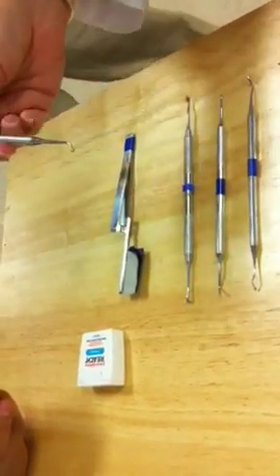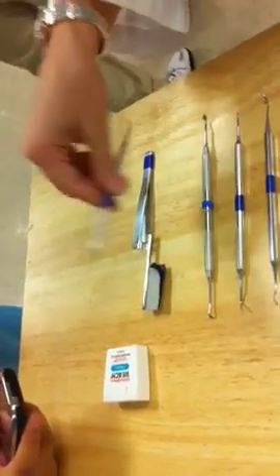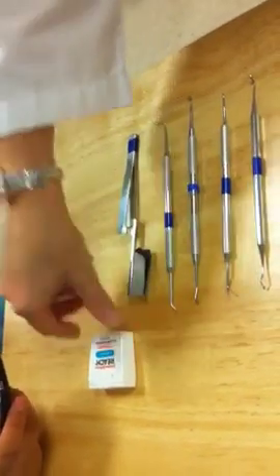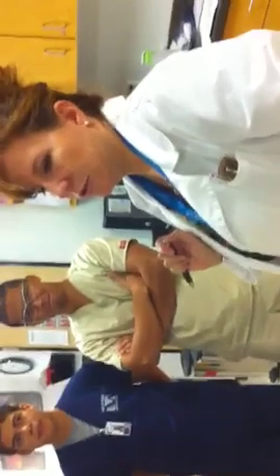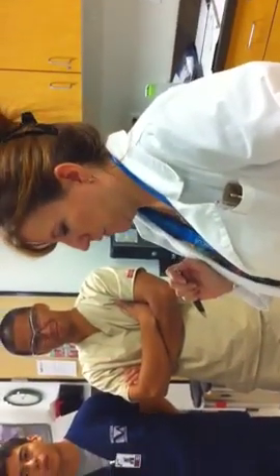Then he will smooth it with the ball burnisher, get the tooth nice and smooth, and he will check the interproximal surfaces with the floss to make sure there's no overhangs. Then you're going to rinse the patient out really, really well, get all of the amalgam scrap out of there, and you're going to tell the patient to not chew on it for 24 hours, as the filling material needs 24 hours to set, and if they bite on it, they will crack it. And then you will send them up front to get their next appointment. Ta-da!